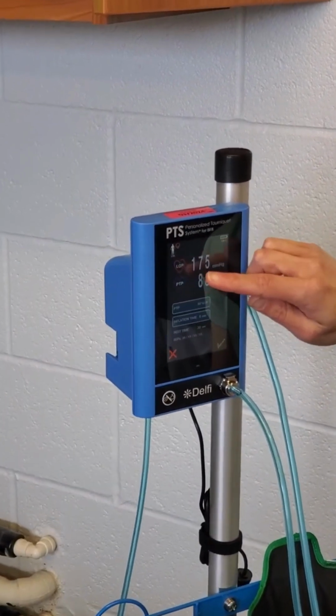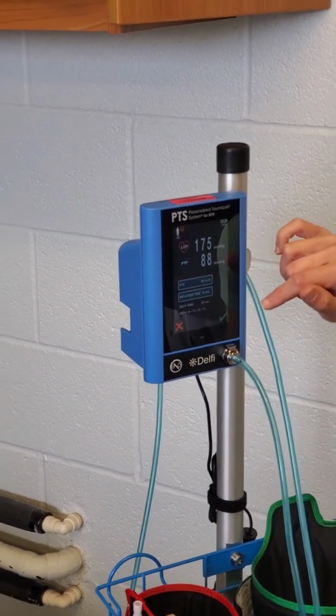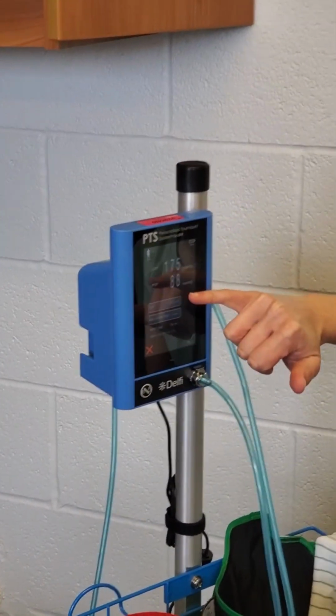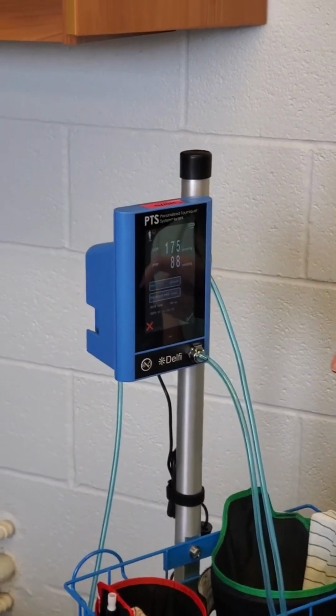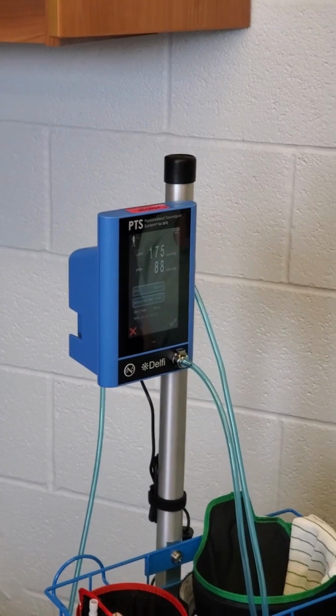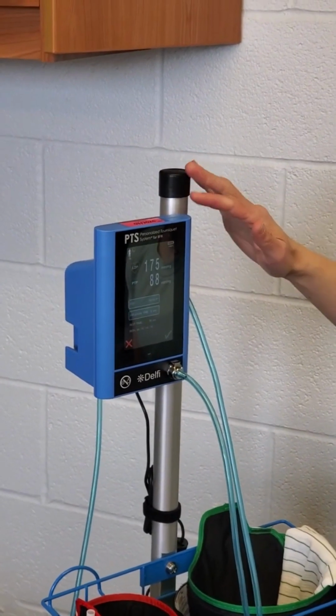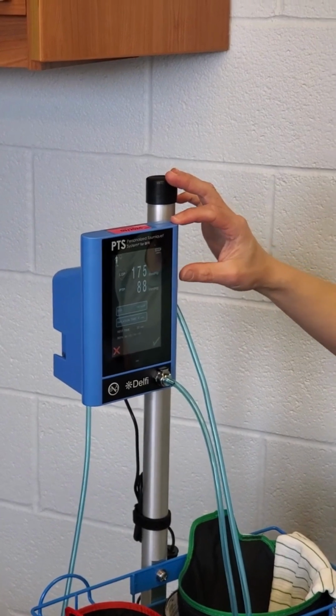So her limb occlusion pressure, 100%, is 175 millimeters of mercury, and then her personal tourniquet pressure is 88. And that's at 50% limb occlusion pressure. Does that make sense? Okay. And then I guess we can just keep it at that.